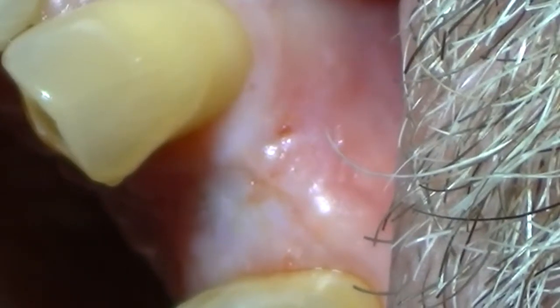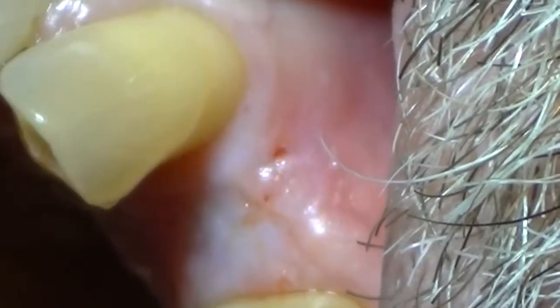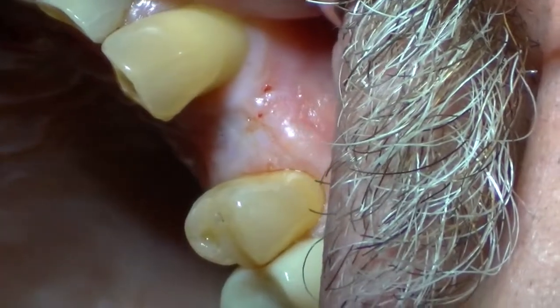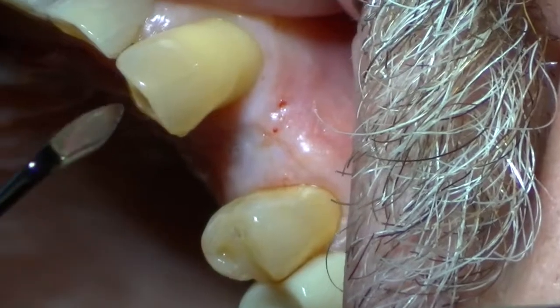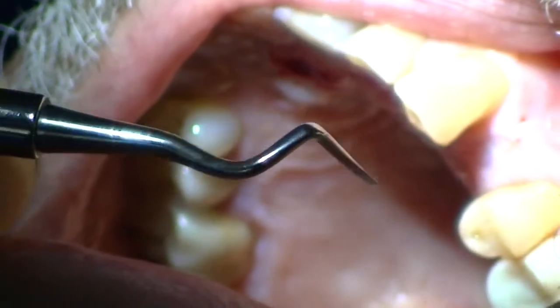And again, I always tell the patient, you're in control. Anything bothers you, if you could just raise your hand and we'll get this done, okay? So what we're going to do is I'm going to take my Orban knife. And again, we talked about this before. It's a sharp stainless blade.